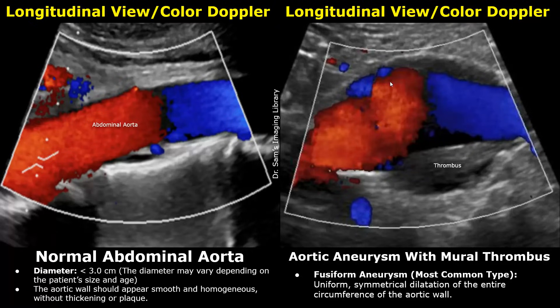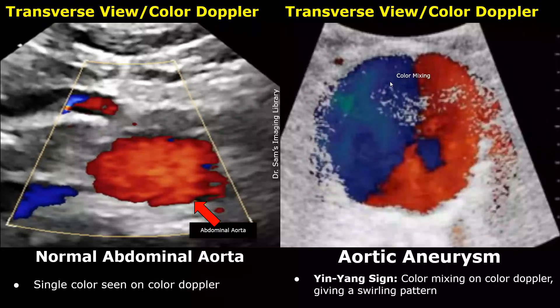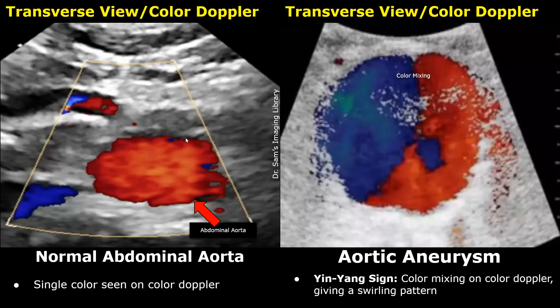This is how a normal aorta appears on color Doppler in transverse view — only a single color, usually red, is seen inside the aorta. You can see the mixing of colors much better in the transverse view. A swirling pattern is seen on color Doppler in the transverse plane. This color mixing pattern is named the yin-yang sign.